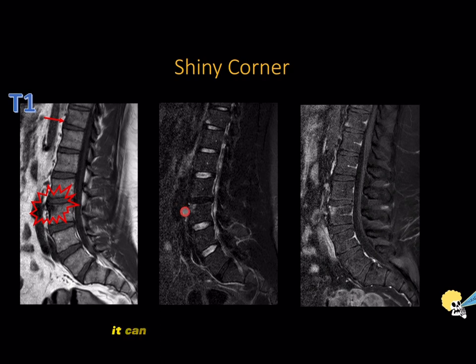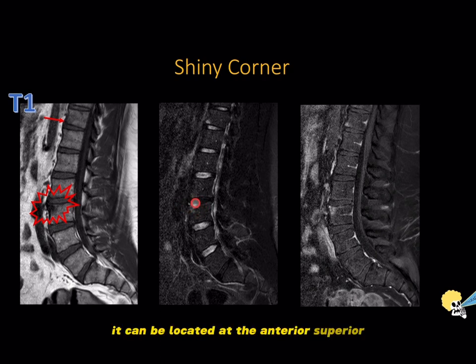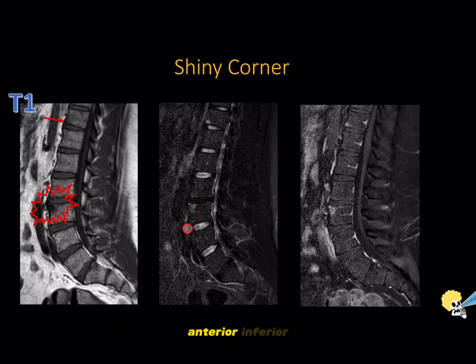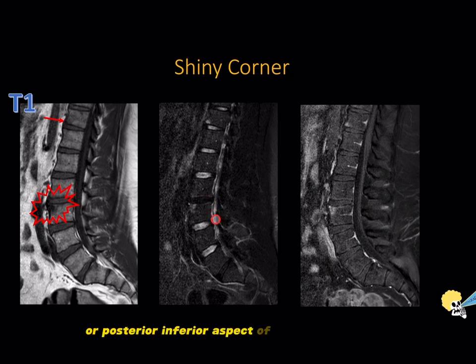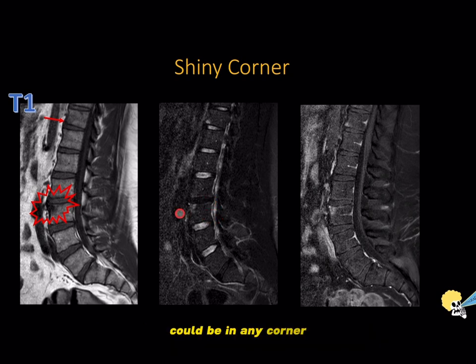It can be located at the anterior superior, anterior inferior, posterior superior, or posterior inferior aspect of the vertebral body — it could be in any corner.